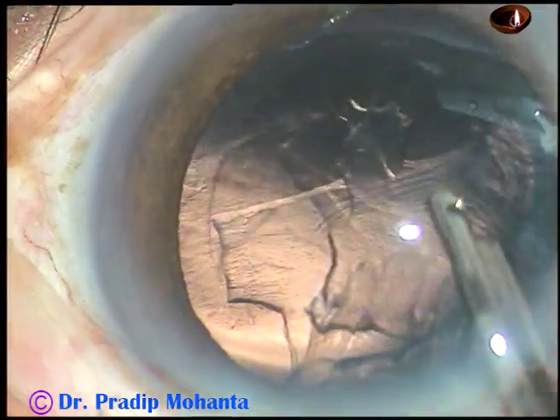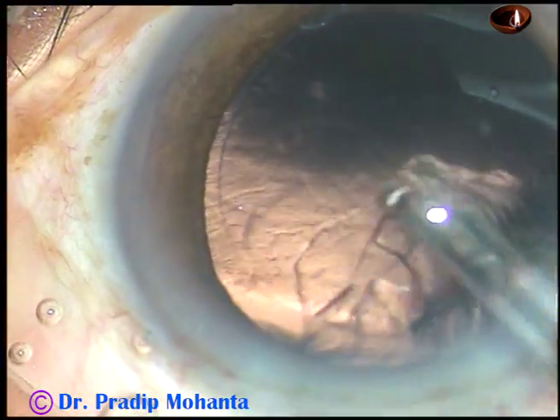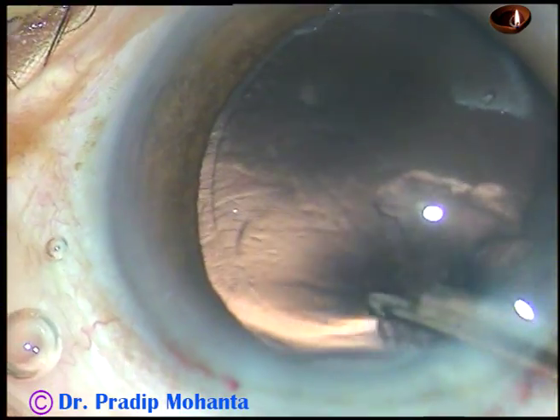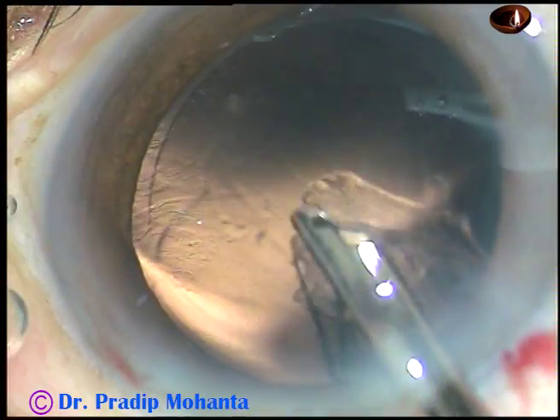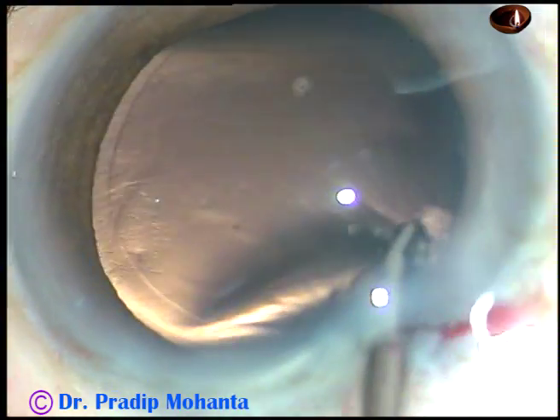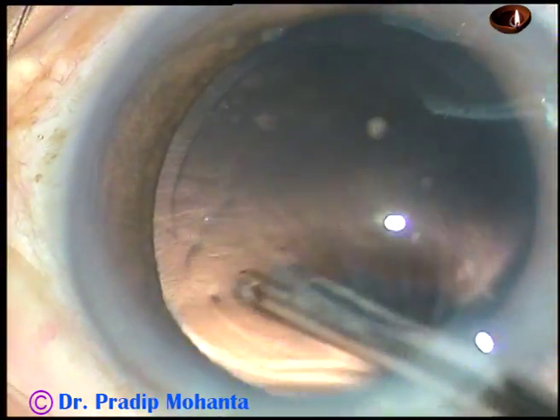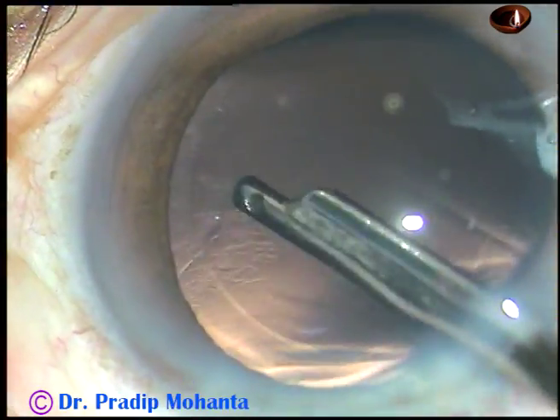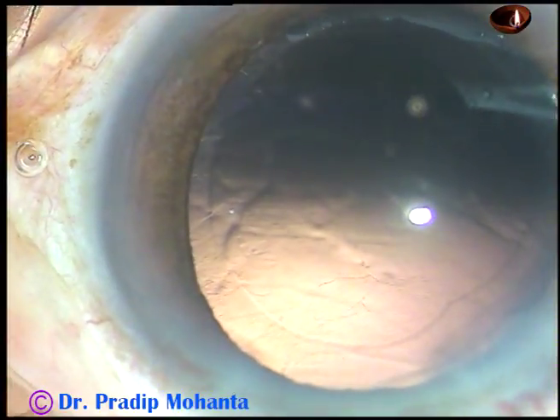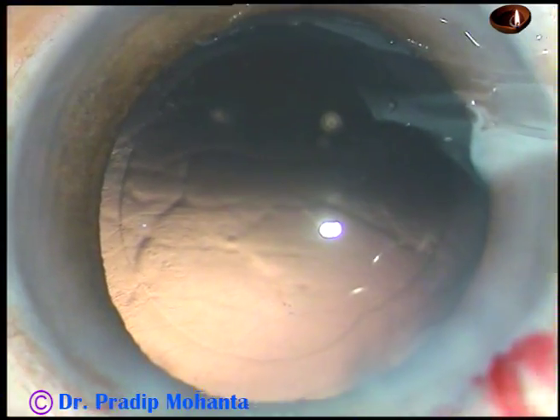Since there is only one side port, you can use either coaxial I/A or this very simple instrument — a 23-gauge Simcoe cannula — and the cortex is removed. The posterior capsule is quite clean, with one or two fibers sticking here and there.